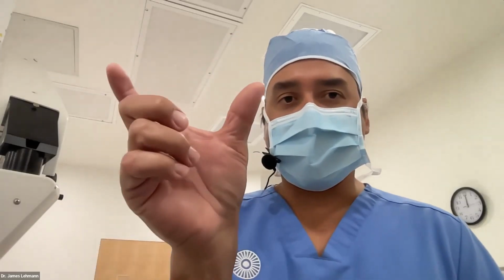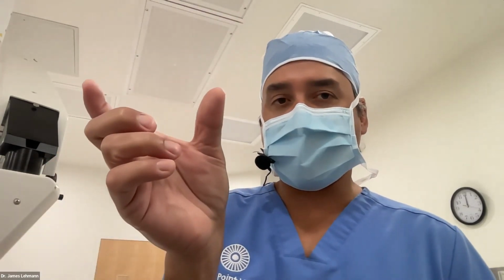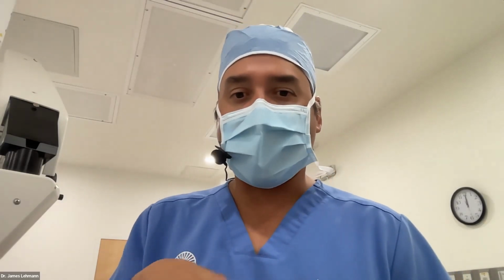The cornea, as we know, has a wider horizontal than vertical diameter. So when you operate horizontally, temporally, you induce less astigmatism and you've got more room. The problem with superior is you're kind of up in your operating space, much closer to the center of the cornea. So visualization is worse. And if people have steep brows, you're coming in at too steep of an angle. You can't come in like this.